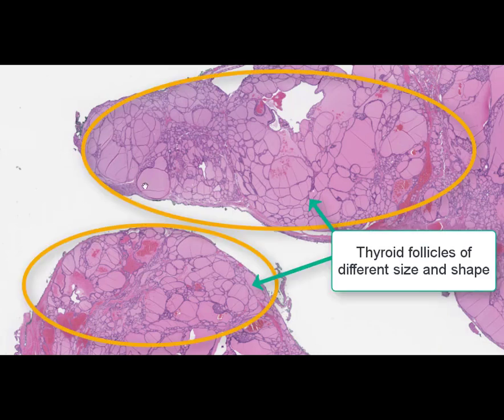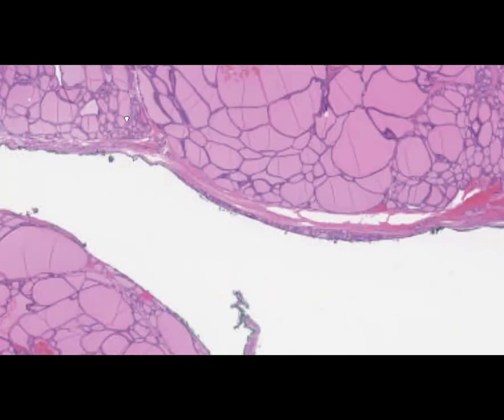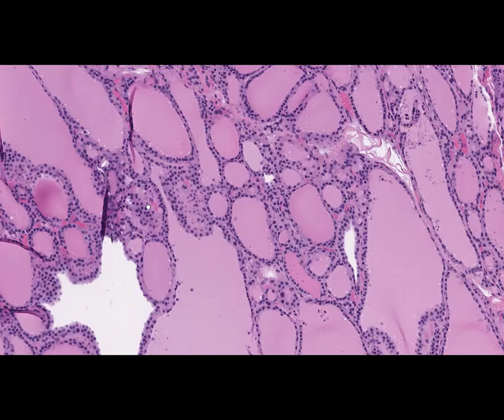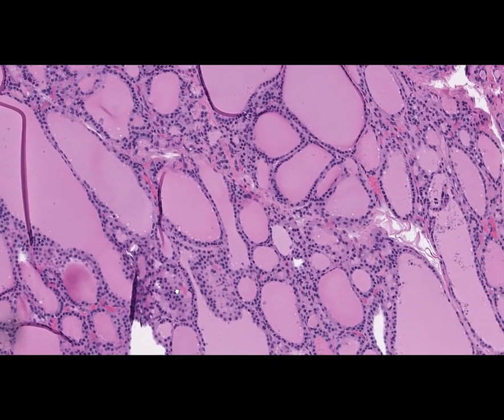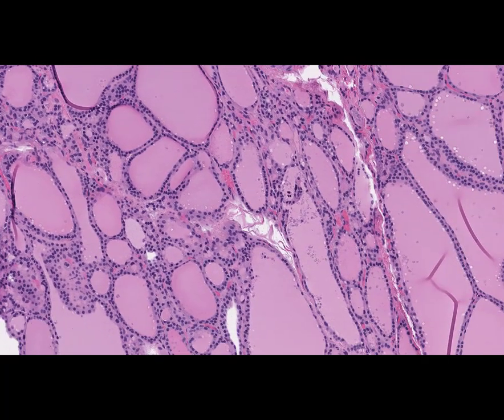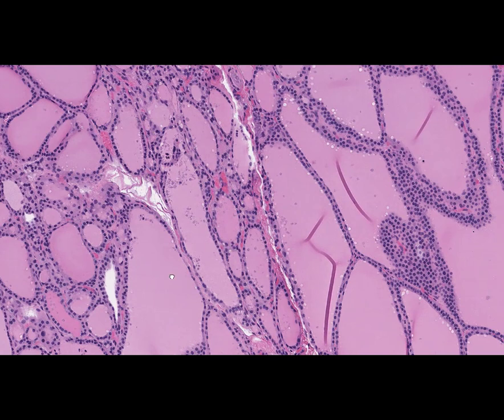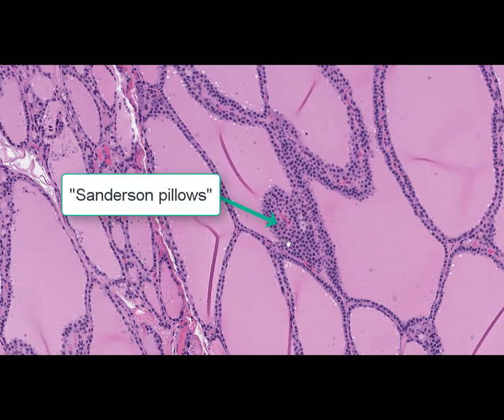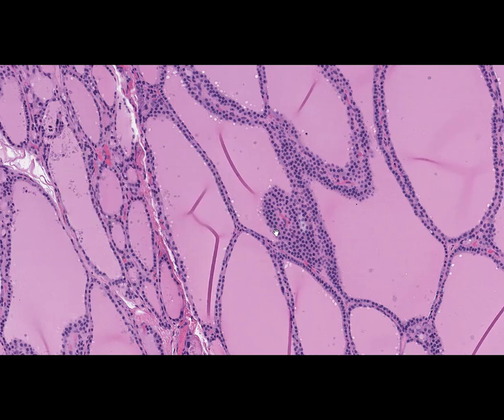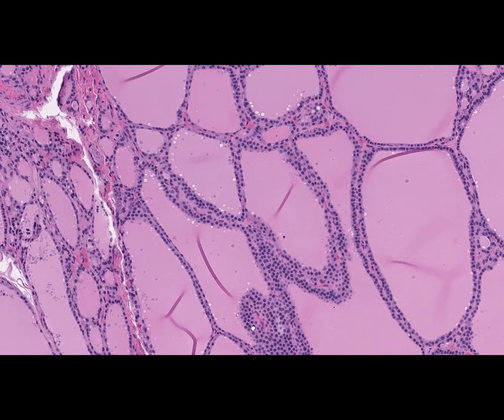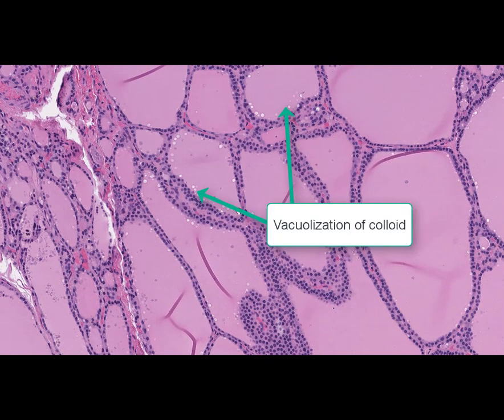At high magnification, we can see that the follicular epithelium becomes taller or cylindrical. The follicular epithelium forms outgrowths protruding inside follicles, which is typical for Graves' disease — such formations are commonly known as Sanderson's pillows. Sometimes the colloid substance undergoes dilution, seen in the form of colloid vacuolization within the thyroid follicles. Diffuse lymphohistiocytic infiltration can also be seen in the stroma of the thyroid gland.